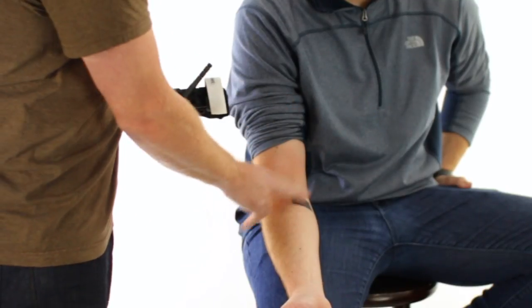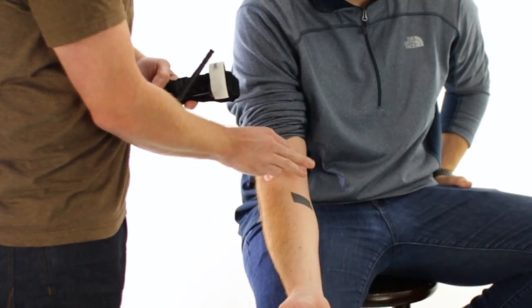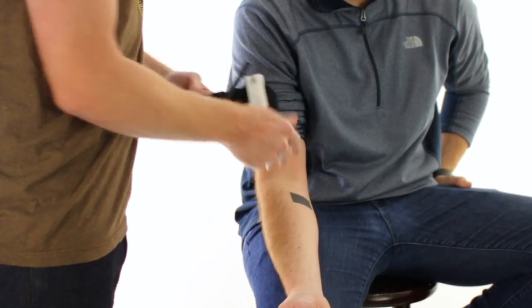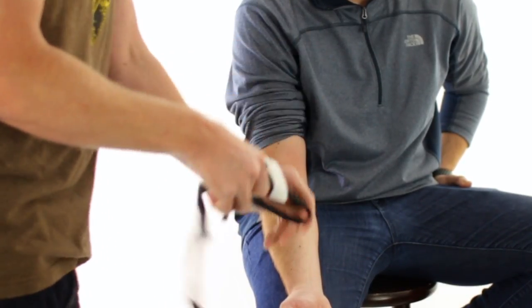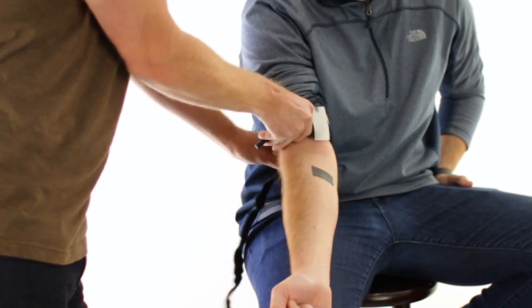Locate the wound — this is going to be where the blood is spurting out of. Our ideal location is going to be about two to three inches above the wound. Slide the tourniquet over the extremity.